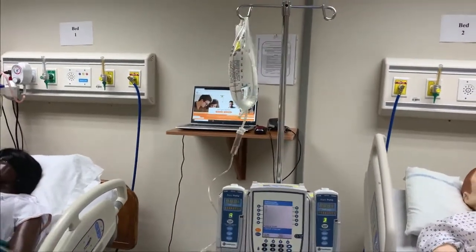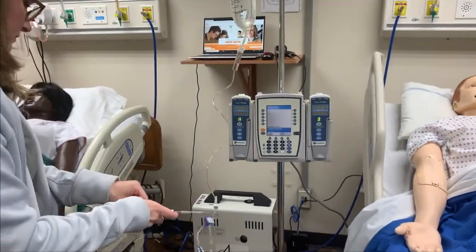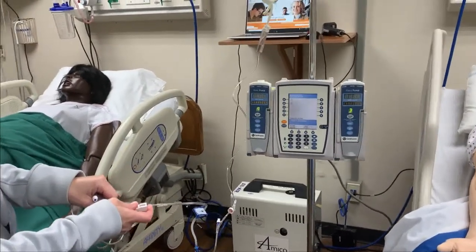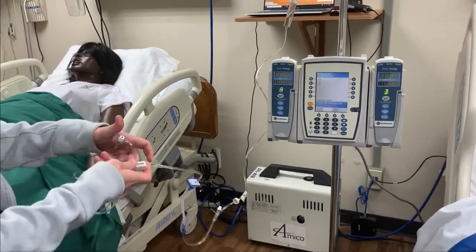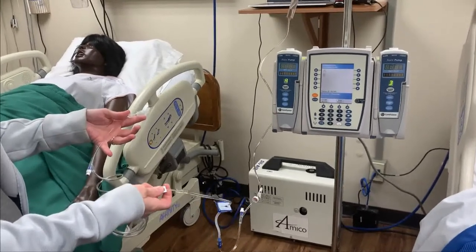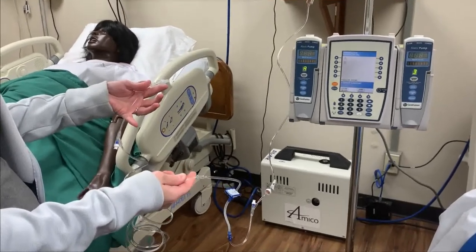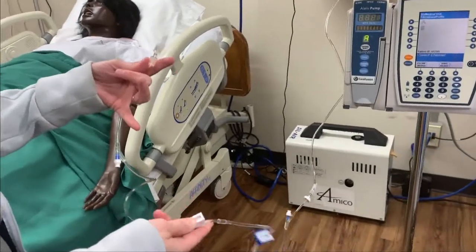Once I have that in place, you can go ahead and prime your tubing. Start slow, making sure there's no air being created. Alright, my tubing is primed.